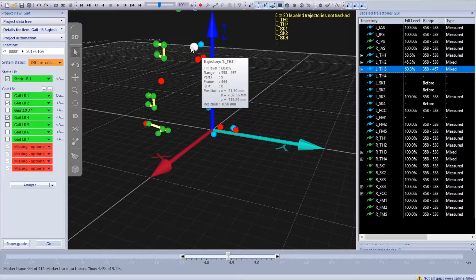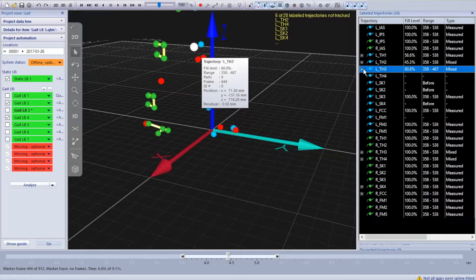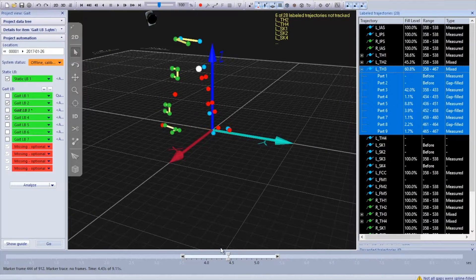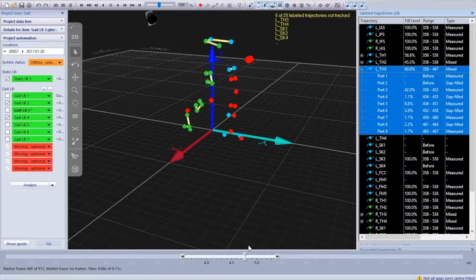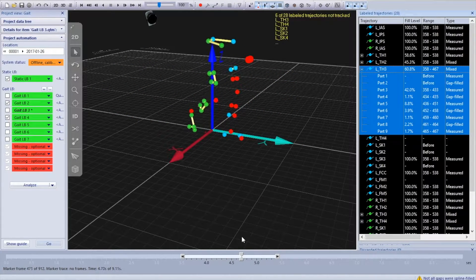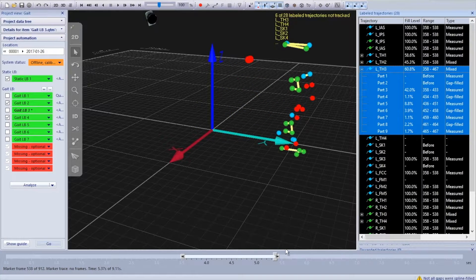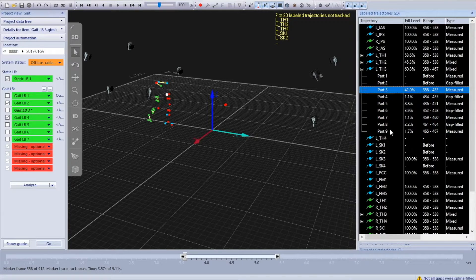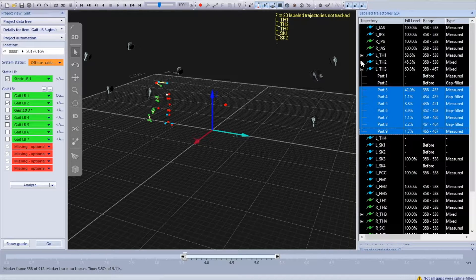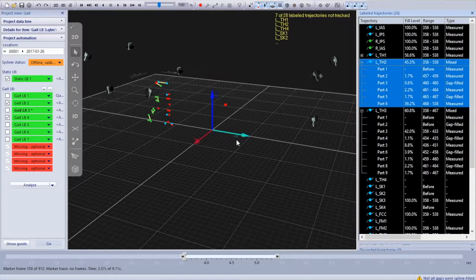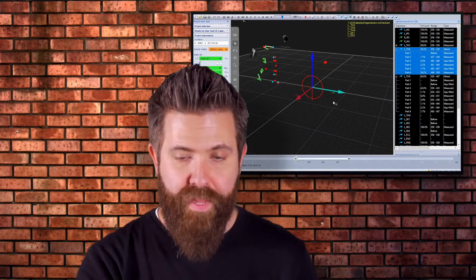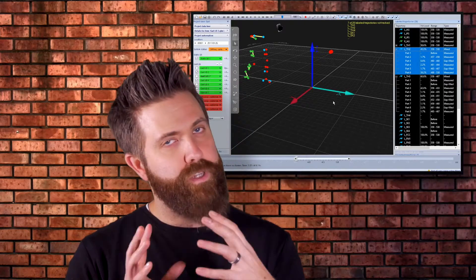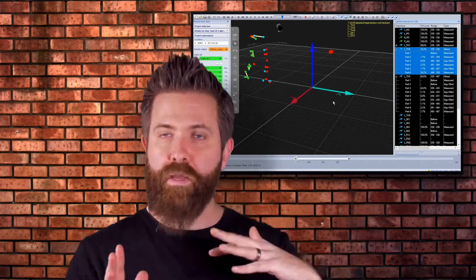Here's a different example where I know for sure this is supposed to be LTH2, but it was mislabeled as LTH3. I first want to make sure it's been mislabeled for the entire trial — and actually it was not. LTH2 was labeled correctly for part of the trial, so I'm going to drag these to measure correctly. Doing this is actually highlighting a different issue: unlabeled was very easy to fix.